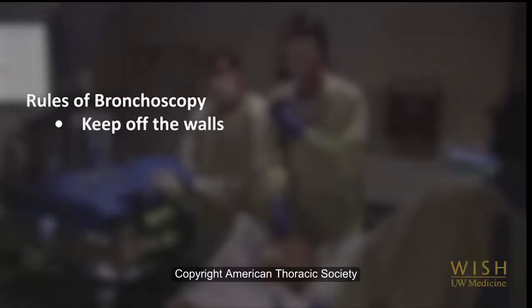Keep the tip of the bronchoscope in the center of the airway. This reduces trauma to and irritation of the airways. Keeping the image in the center of the screen also helps those watching you to know where you are and to feel less dizzy. If you cannot see where you are going, advancing could lead to trauma. Try to clear the tip of the bronchoscope with gentle suction or by instilling 3 to 5 milliliters of saline through the suction channel. You can also try to wipe the tip of the bronchoscope on the wall of the trachea.